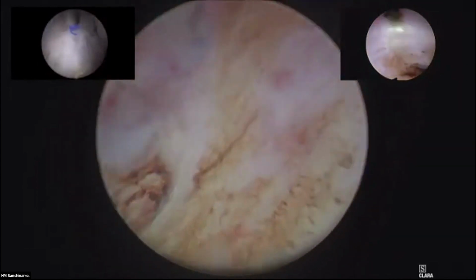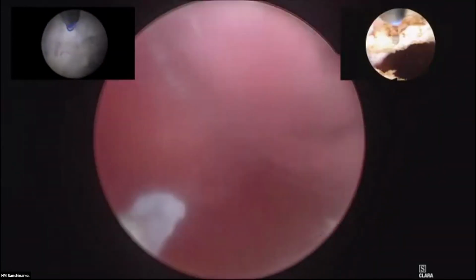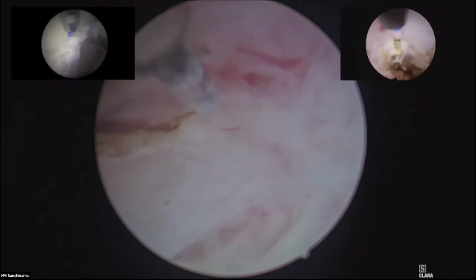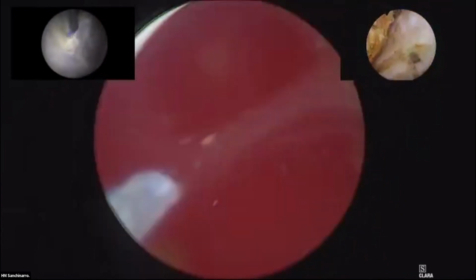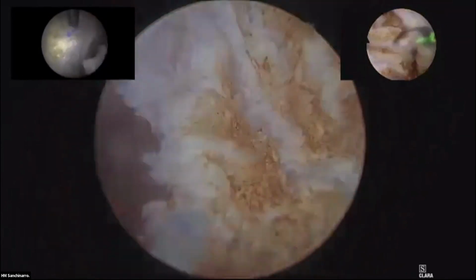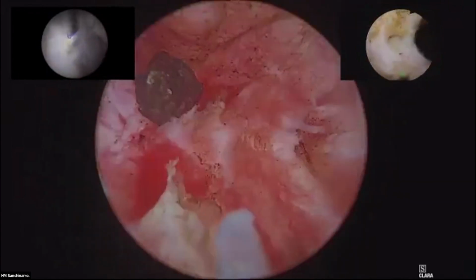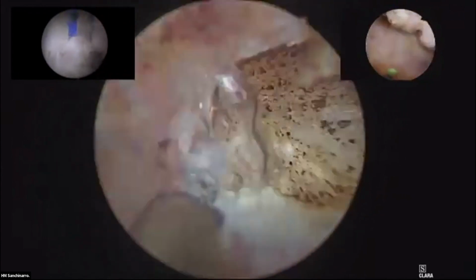Can you show us the sphincter of the first lobe when you could? Oh, okay. Here you have the sphincter, and it's already detached, and this is the lobe I'm working on. Okay? Yeah. But the first lobe is still in there. No, it's not completely separate in the mucosa. The other lobe is in the bladder, and it's somewhere here. Oh, no, don't worry. Here. Okay. Yeah. But yeah, there's some. It belongs to this lobe. Yeah. We'll see. Actually, it belongs to the same prostate, and perfectly. It's me that has decided that it belongs to this lobe.